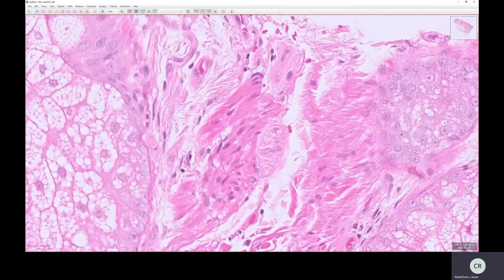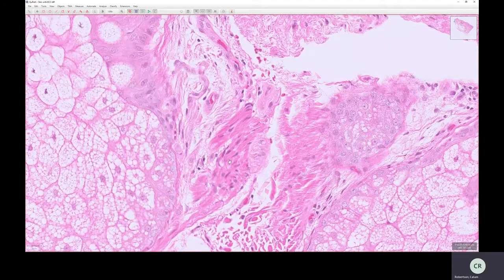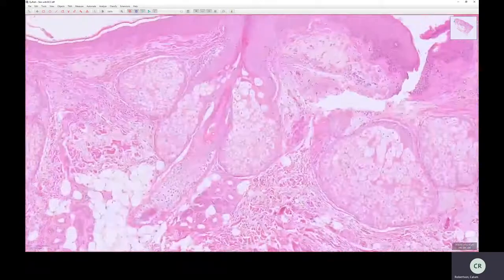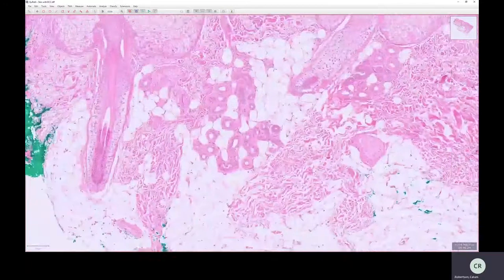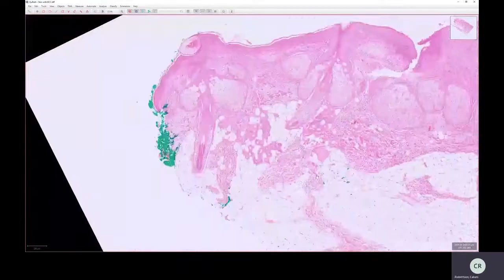This is not the best example, but we'll maybe come across others when we scoot around. But a smooth muscle cell has an elongated nucleus like this one here, like this here, and bright pink cytoplasm round about it. The nucleus is placed right in the middle of the cell, and the cytoplasm is round about it.